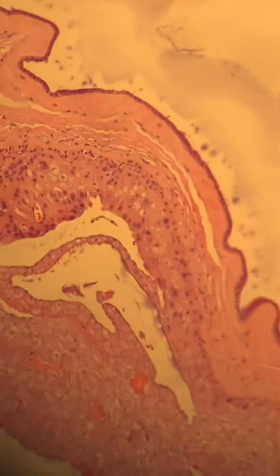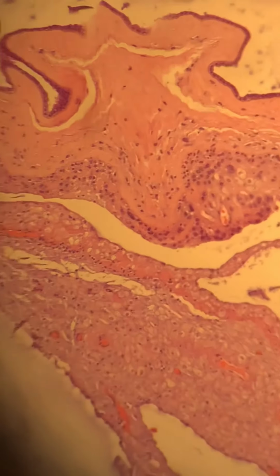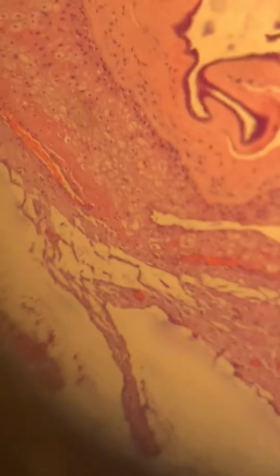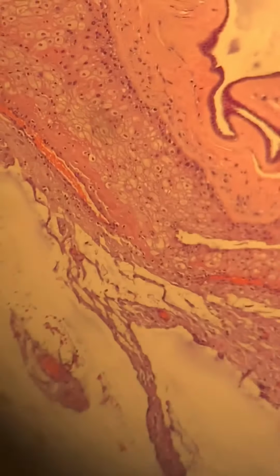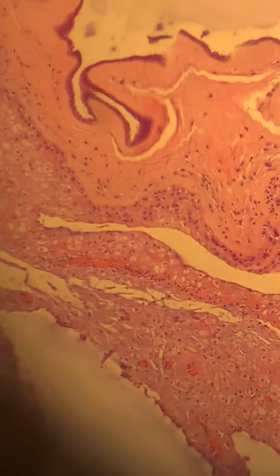So in this video, if I can keep it focused, you see this is the membrane from twin A, the fetal membrane from twin A. And you can see that there is definitely meconium histiocytosis, and there's early acute inflammation involving the amnion. If I can just keep it in focus here, it's difficult with my little gadget.